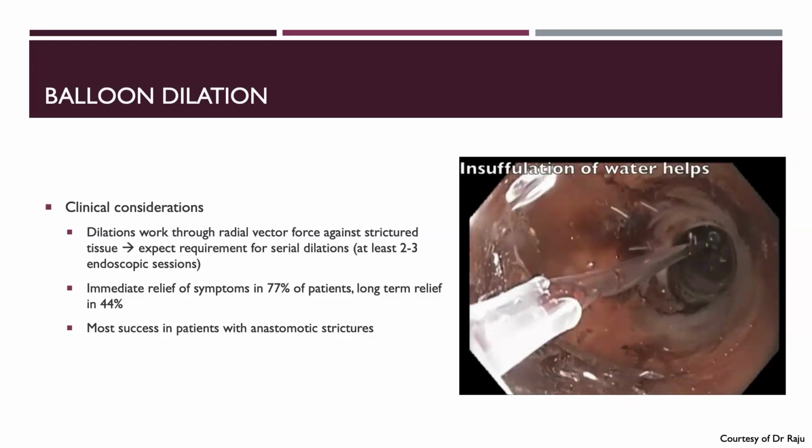The reason this is important is this is a nicely controlled stricture dilation, as controlled as you can get, because you can see how the tissue responds. So for example, if I'm looking into this balloon and I see a lot of this red tear coming up and up, I'm going to tell my tech to stop.